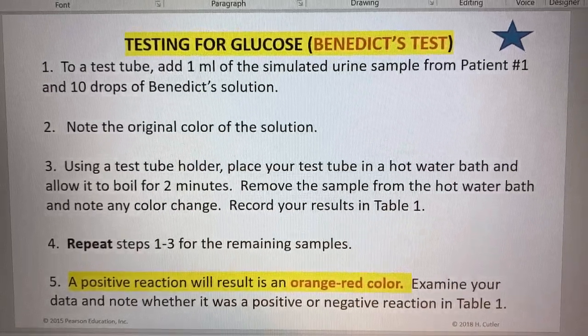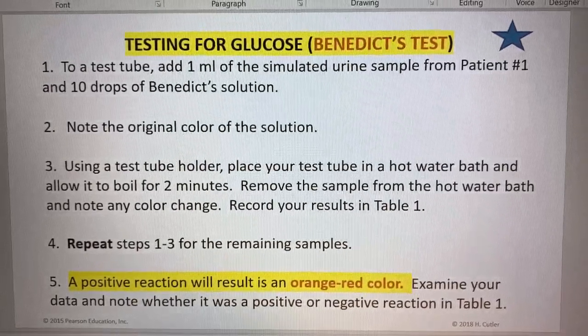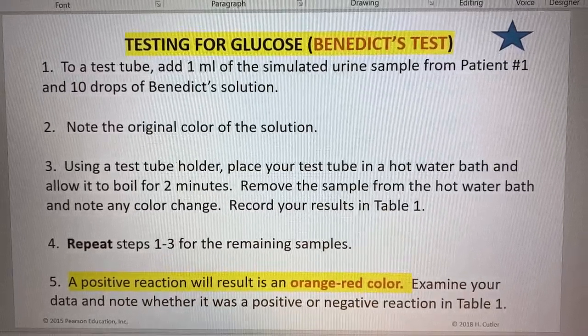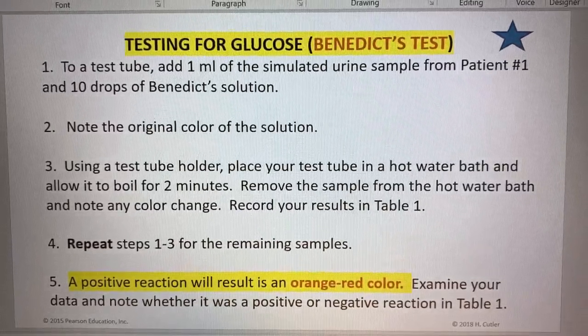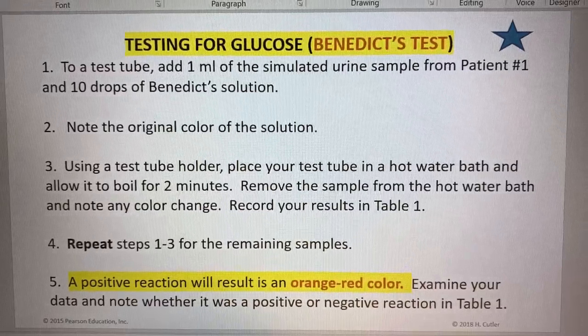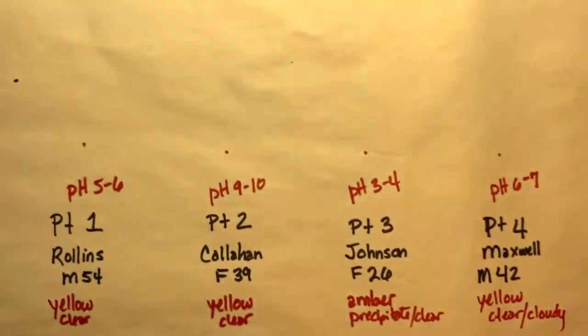We need to see what the color is to begin with when we first add the Benedict's and urine. Then we need to boil it for two to three minutes, which is what you have to do with Benedict's solution, and then we'll see what the color is at that point.